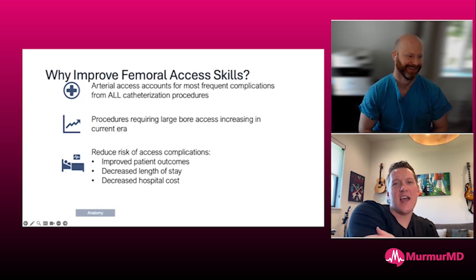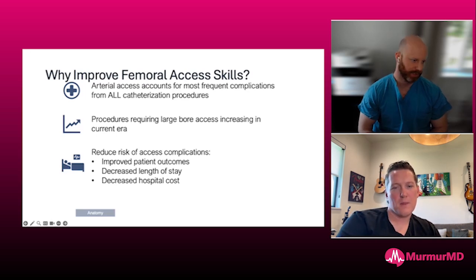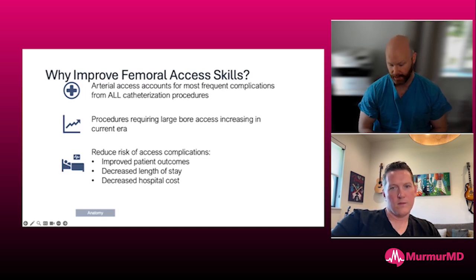So now we're going to get into the actual best practices of femoral access. Take us through that. I think it's important that we are all constantly improving at everything we do. I think that's why people like Murmur and why the operators are on Murmur, because everybody's learning from each other. And I think it's important that we continue to improve our femoral access skills. I think we've come a long way even in the last 6 or 8 years with regard to how we address these things, protamine being a huge part of them. I think the way that we deploy multiple percloses or even single perclose closure, so you don't have so much pinching at the arteriotomy.